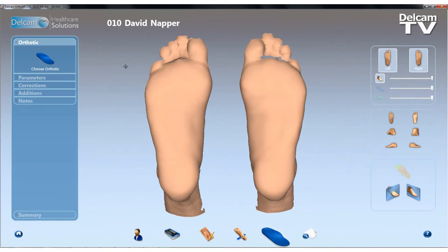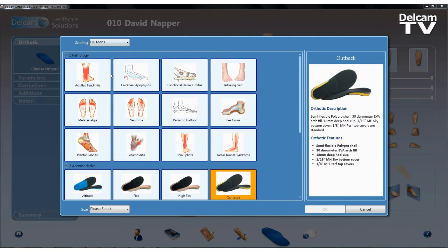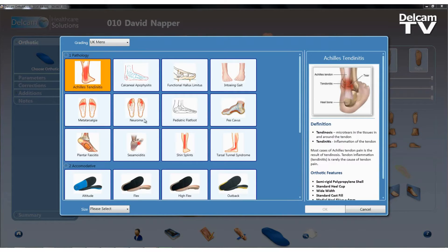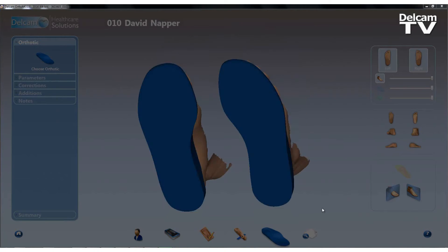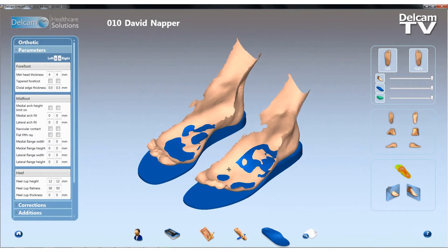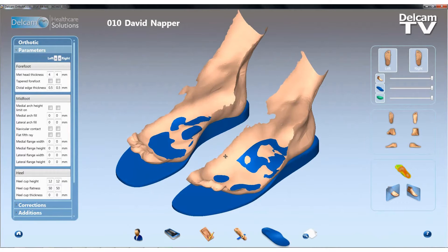I'll move straight forward to the design option and select the footwear sizing system I'm going to be using. In this case, this is a UK men's size 9, and this will create a pair of custom orthotic insoles for these particular feet.